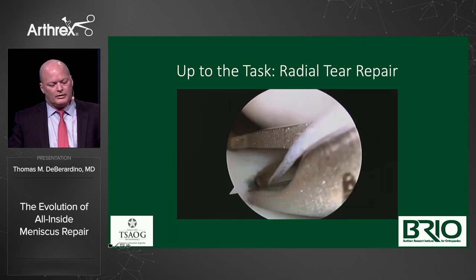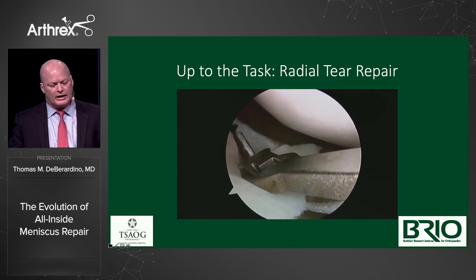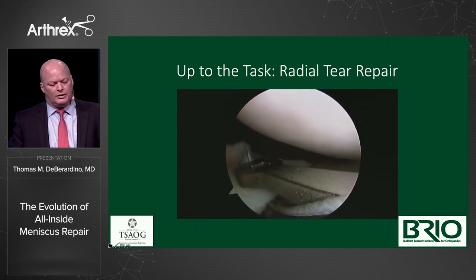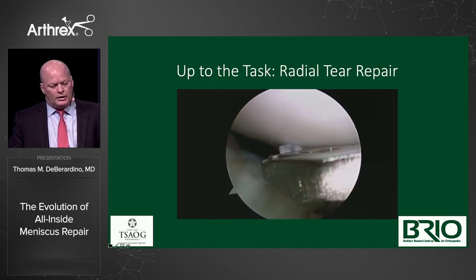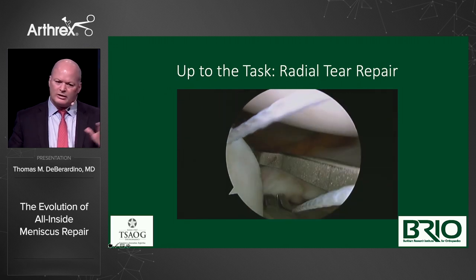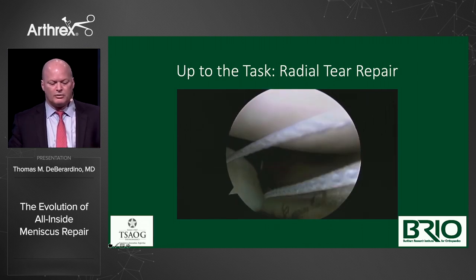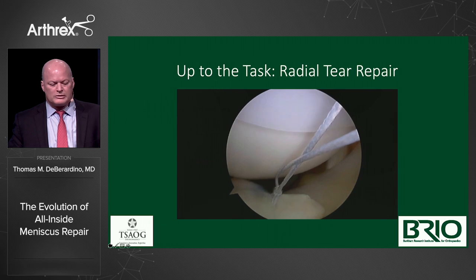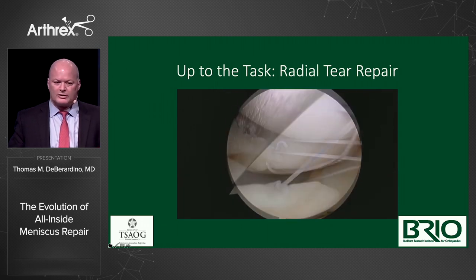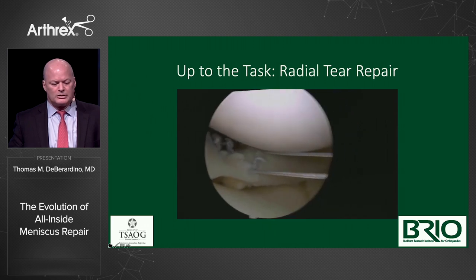Coming in on the anterior side, getting a bite, self-capturing, then moving right over without taking the instrument out, and then tying our knot down through our passport cannula. It's very easy to do, low profile, less iatrogenic injury. We always say release the MCL at all costs because we're there to save the cartilage. We always remind people teaching courses: we're there to do no harm, to protect the joint or restore it. The last thing we want is iatrogenic cartilage damage.